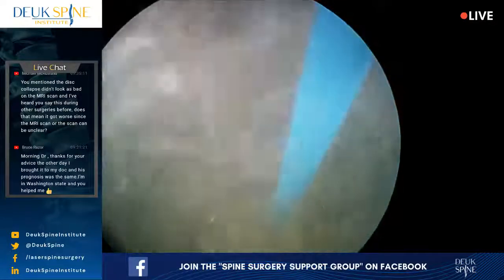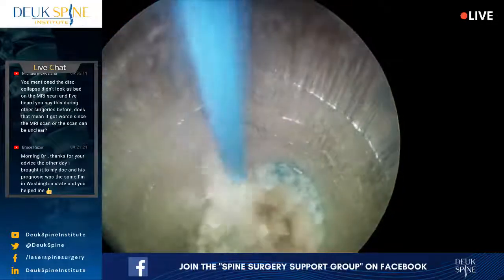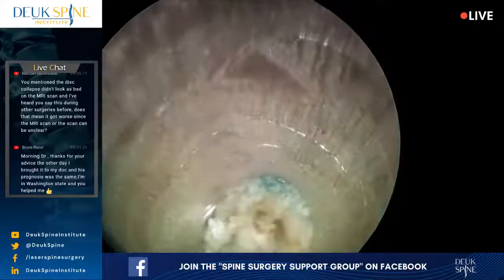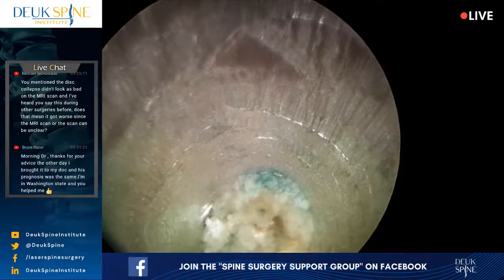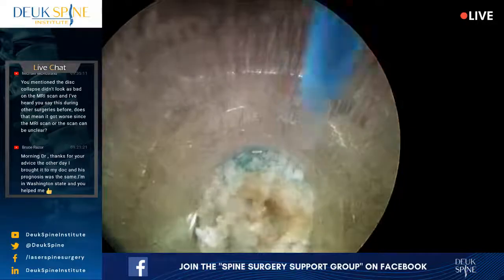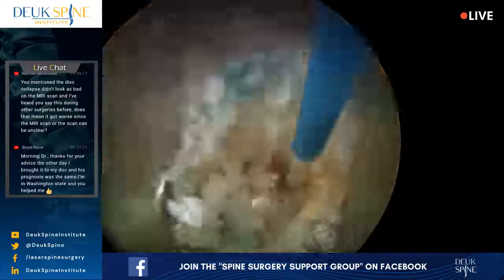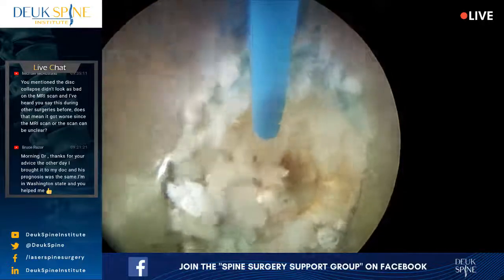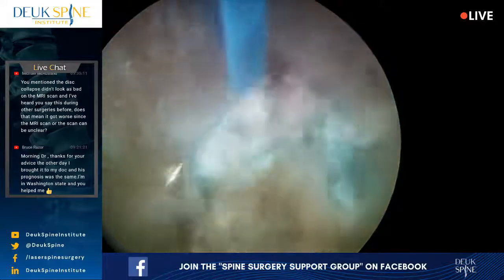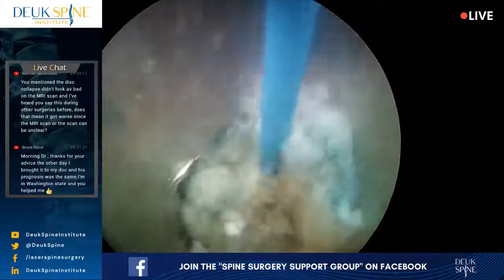So what are we doing here, folks? We're doing surgery to cure back pain. We're doing surgery to cure her leg pain. Everyone knows surgery can be done to cure leg pain or sciatica. What people don't know is that surgery can be done to cure back pain. And I don't mean getting lucky once in a while and curing back pain. I'm talking about 100% of the time curing back pain. That's because the right diagnosis was made and the right treatment is being done to address the actual source of the back pain, which is the annular tear right here. That's what I'm debriding.